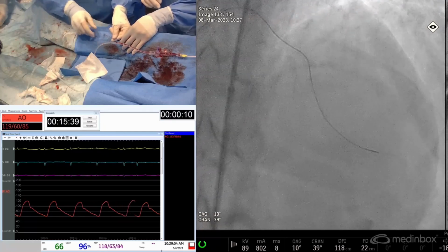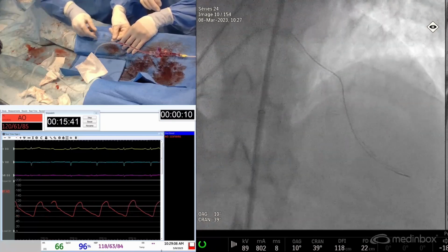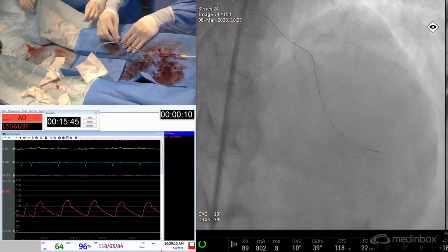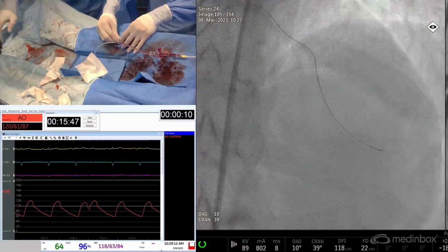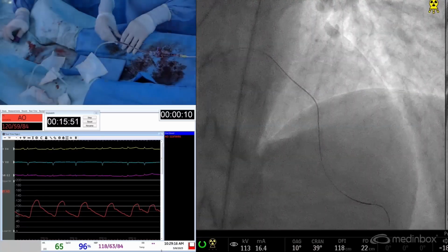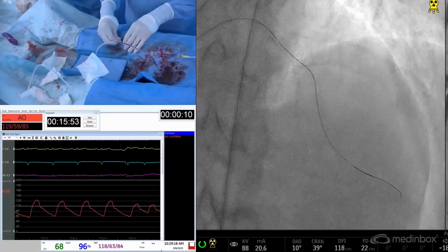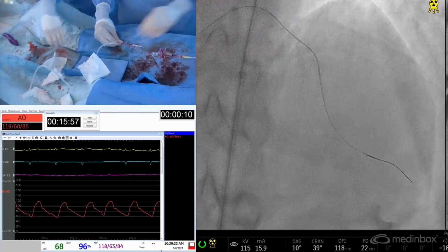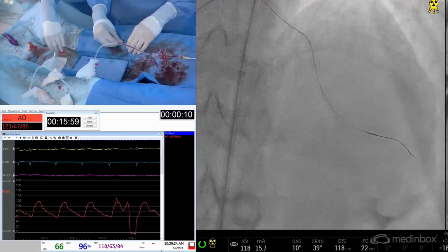You also have, at least in Canada in the last 4 or 5 years, IVL. The shockwave balloon has done its way through our landscape and made it much safer for all of us to tackle such lesions.